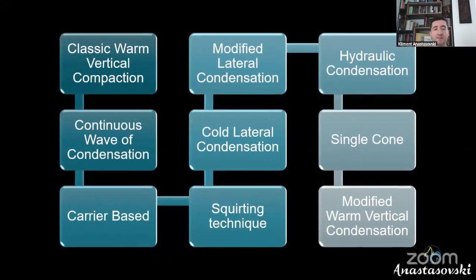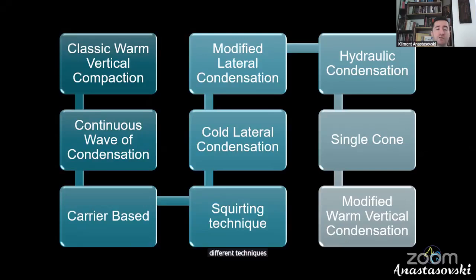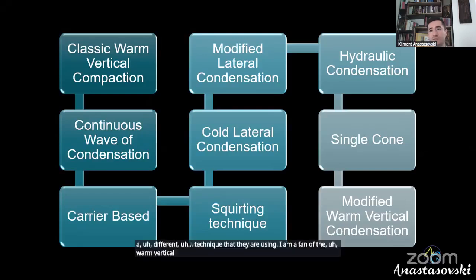And as the last step of this root canal procedure, it is the obturation step, where we need to three-dimensionally fill all the root canal system. There are different techniques from which you need to choose. Every clinician has a different technique that they are using. I am a fan of the warm vertical compaction technique, and that is why I use it in maybe 90 or 95% of my cases.